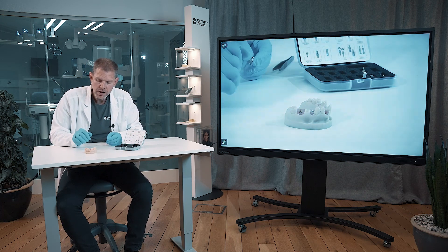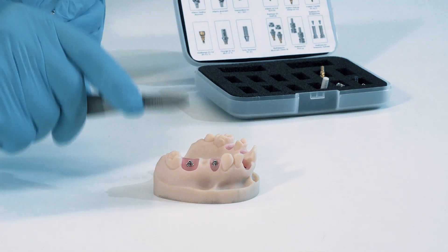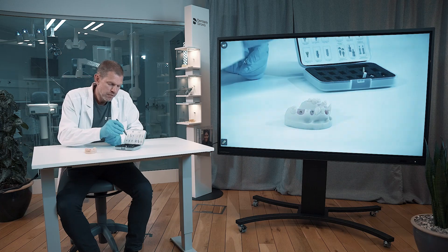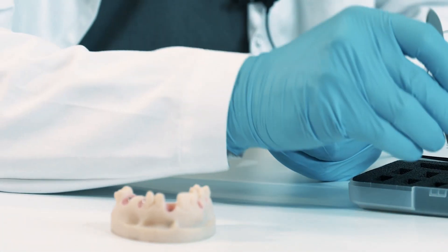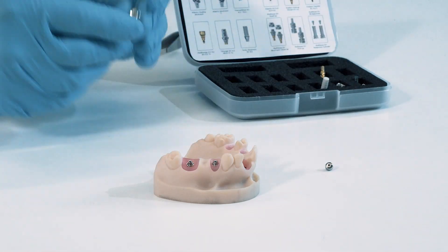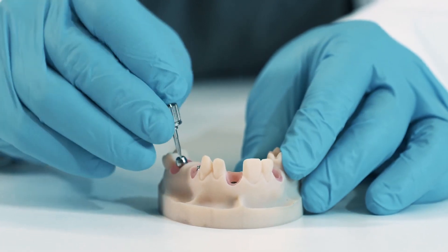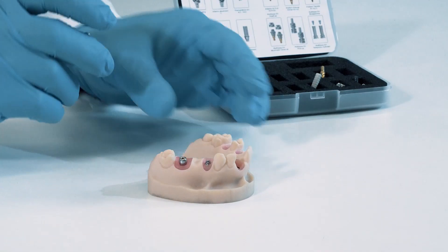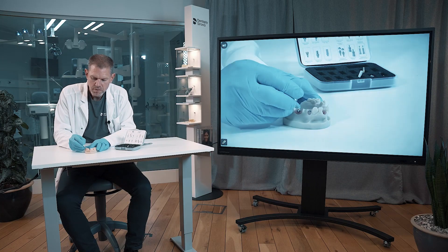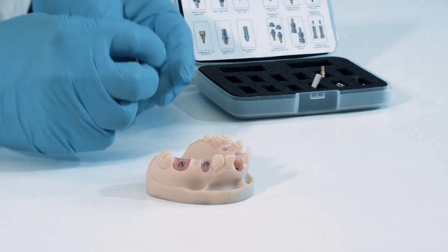Now you have to work at abutment level — doing the healing, the impression taking, and all of the following steps in this sequence. The next step is to put on some healing caps, for which you need to work with the hex driver again. You connect them together and just cover the multi-base with this healing cap and then it heals. Removal is the same procedure, then back into the box.